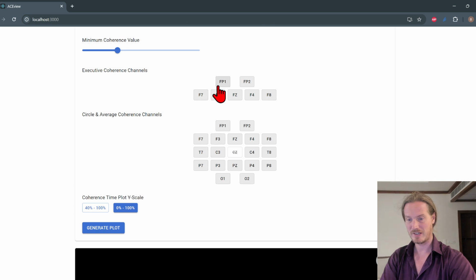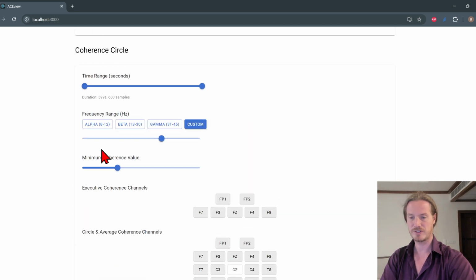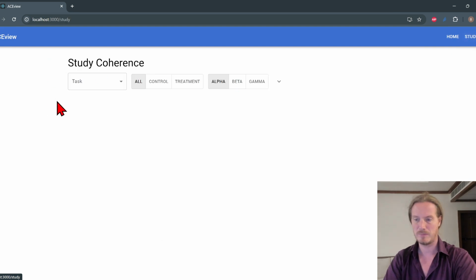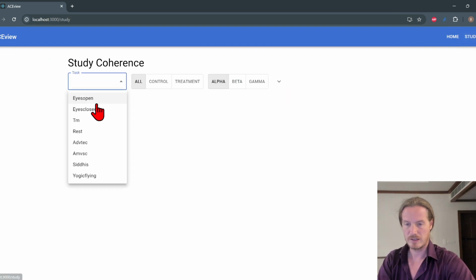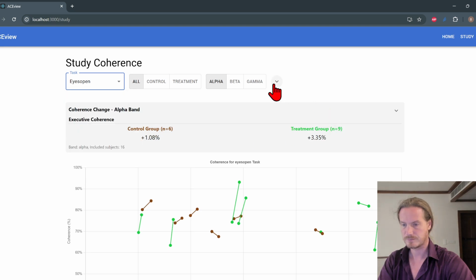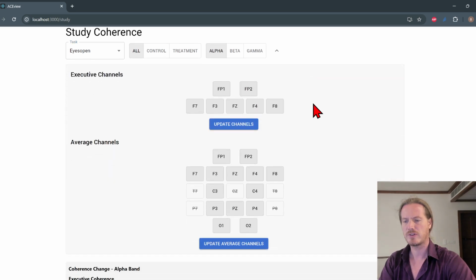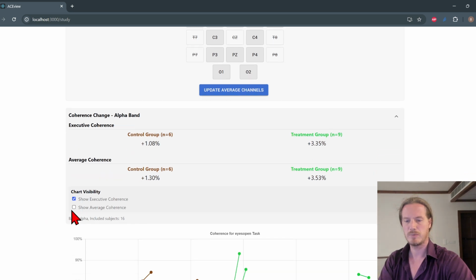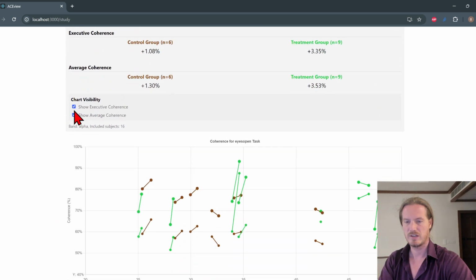And again, here we can change some of the settings of the charts. And similarly in the study tab, let's select eyes open. I already showed that we can go to beta and gamma, but we can also change the channel selection here if we want that. And we can see right now by default I show the executive coherence, but we can also enable to show in the chart only the average coherence, or both, or only the executive coherence.